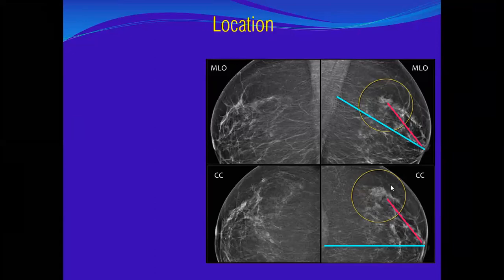Go here to 1, so where it will be 2 and 3. If this one, 2 o'clock, Dr. Rabab. 2, not 1, sorry. This is 2 o'clock. Upper outer 2 o'clock and the depth, the middle. And still you did not say the left. First thing I mentioned, this is left. Okay, sorry. So it is left upper outer at about 2 o'clock, middle third, with the distance from the nipple.